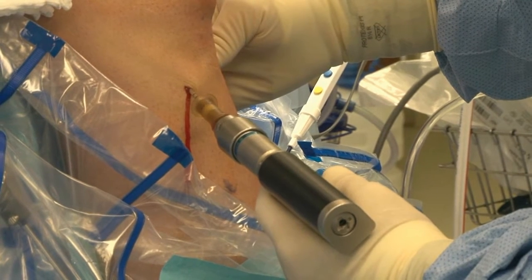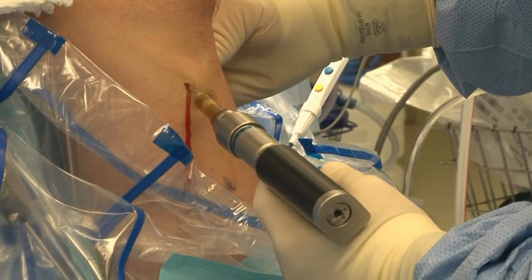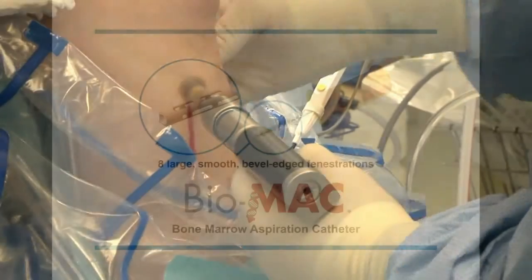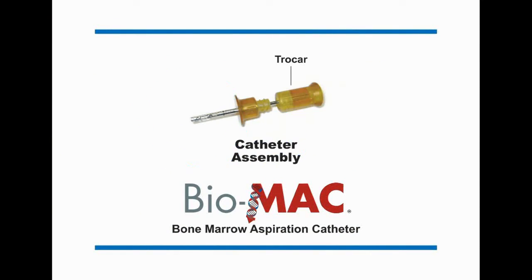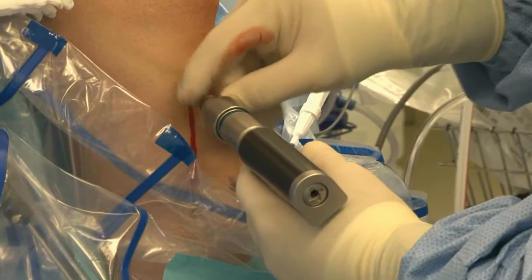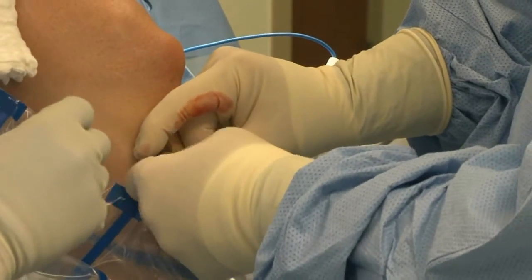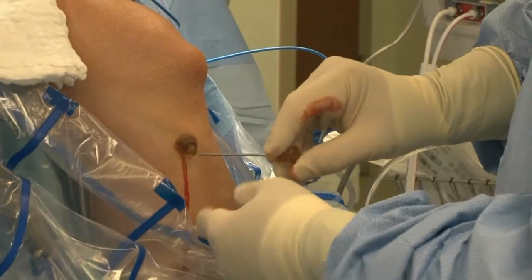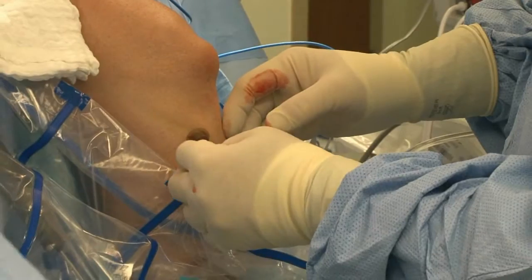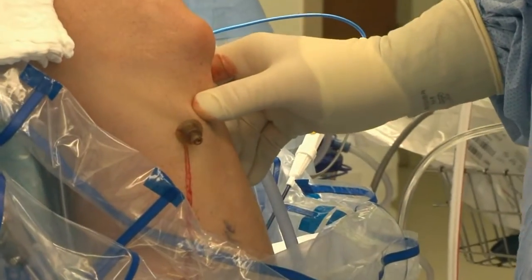Step 7. When the cortical wall is penetrated, advance the Biomac assembly an additional 2 to 2.5 centimeters to assure the catheter's fenestrations lie within cancellous bone. Step 8. Remove the trocar from the Biomac catheter assembly by turning the trocar hub counterclockwise 1 1/2 turns and pulling outward. Then insert the Biomac plunger through the catheter hub and seat fully. Slight to medium pressure may be required to fully seat the plunger. Once seated, remove the plunger.